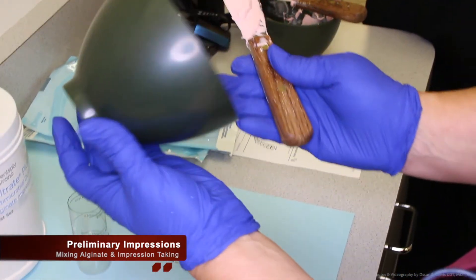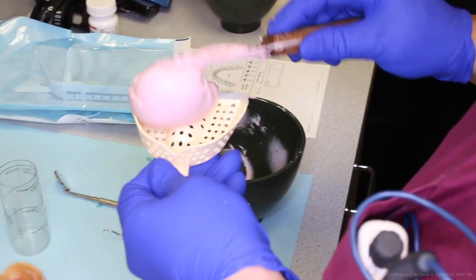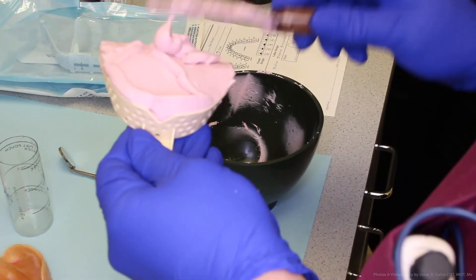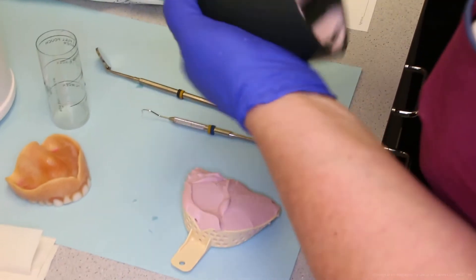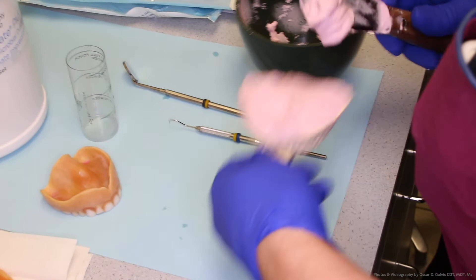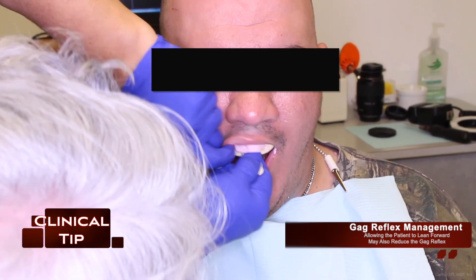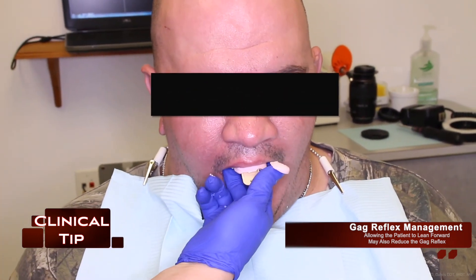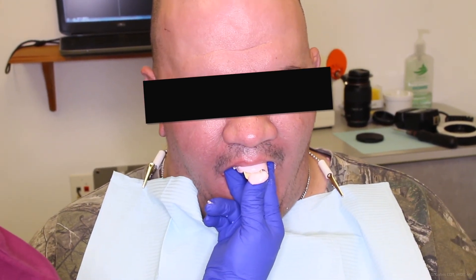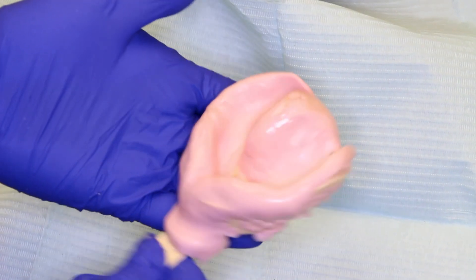Once the proper size stock tray has been selected, the clinician or dentist can mix their alginate impression material and then apply it to the stock tray. The alginate has to be the proper consistency or the impression may come out with voids or bubbles. Here is another clinical tip for patients with severe gag reflexes: allow the patient to lean forward, as this may also reduce the gag reflex. Once the proper setting time has been reached, the alginate impression can be removed from the patient's mouth and then evaluated.